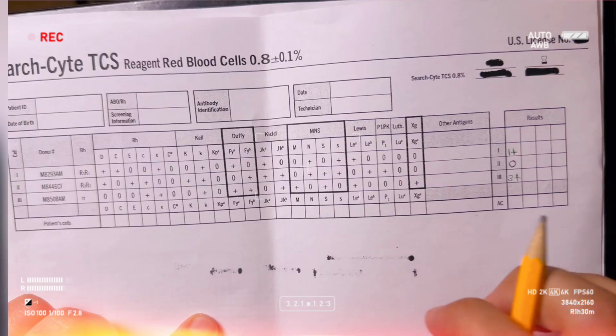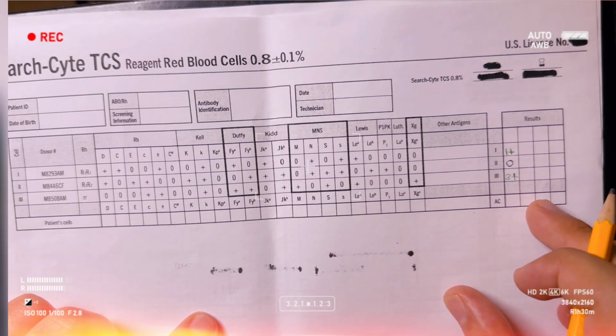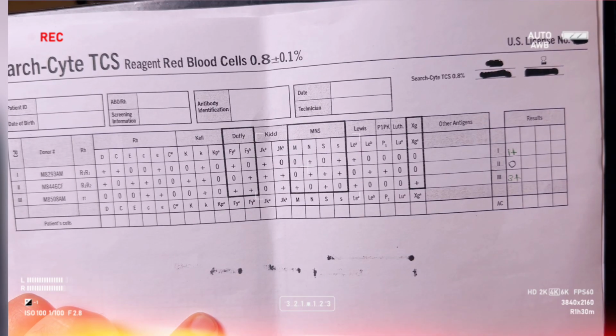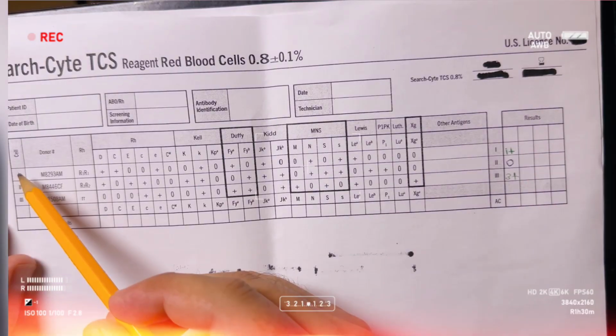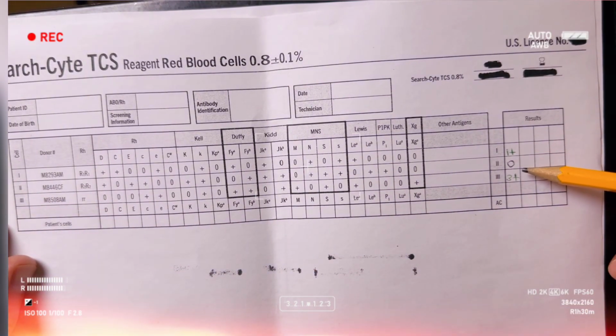First of all we go through the 3-cell screen panel, and I already have my results. You can get the results through tube testing or an analyzer, whatever method you have in your blood bank. I'm using the results from the analyzer. You can also do the antibody screen and panels in the tube. These are my cells 1, 2, 3, and these are the reactions: 1 is 1 plus, 2 is 0, and 3 is 3 plus.